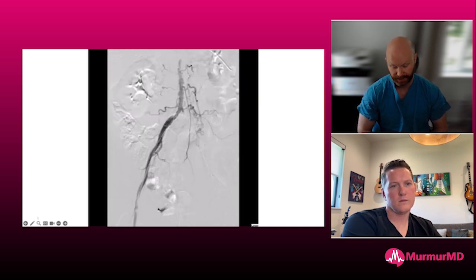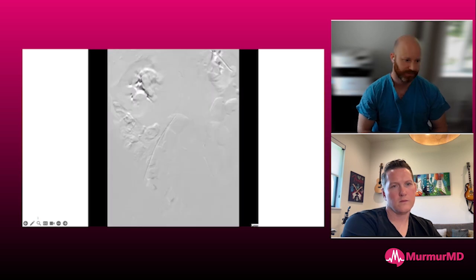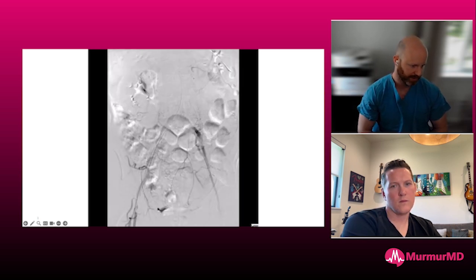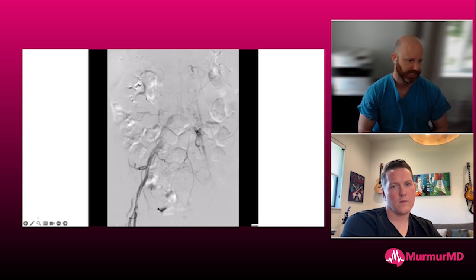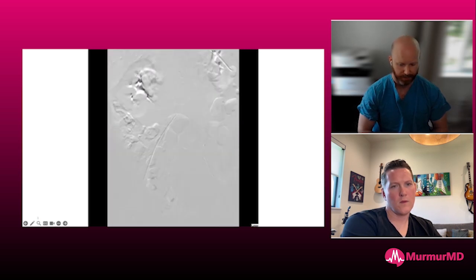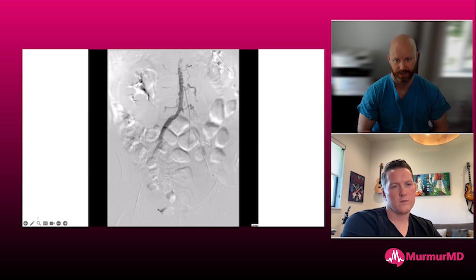And if it's not getting worse, or it's improving, and in her case was improving, we then think that we can safely wean. And we, with our anesthesia colleagues who support us in these complex cases, work through a weaning strategy of between 2 and 5 minutes every 2 P levels, and we work our way down. And as long as they hemodynamically tolerate that, then we go ahead and proceed with explantation.